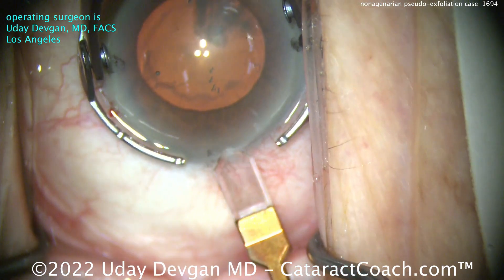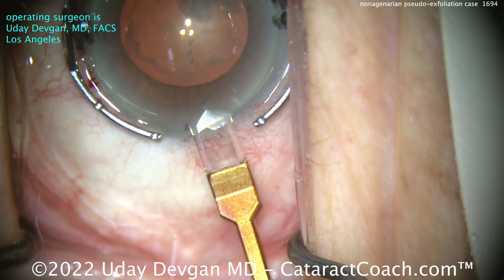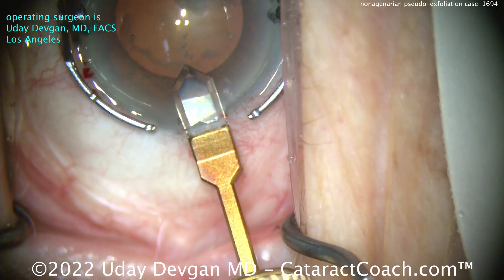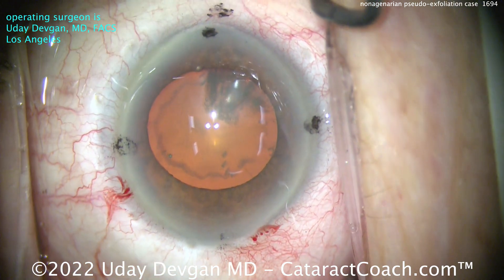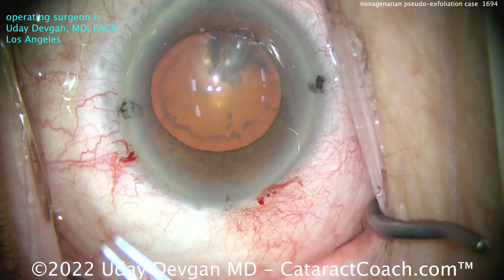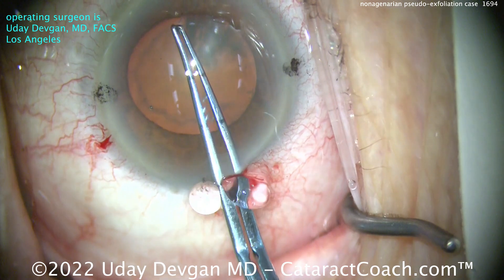The cornea is already marked off. Look at the dots on the cornea — that's the steep axis of astigmatism. Here comes the diamond keratome on that steep axis to make the main phaco incision. There are some black marks on the cornea; those are just some extra reference marks and are not to be used for the alignment. It's those dots on the cornea here.